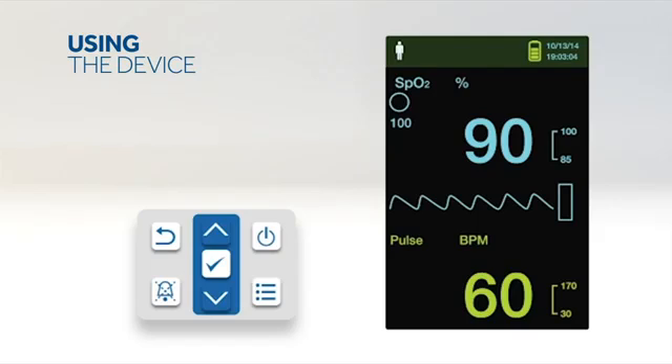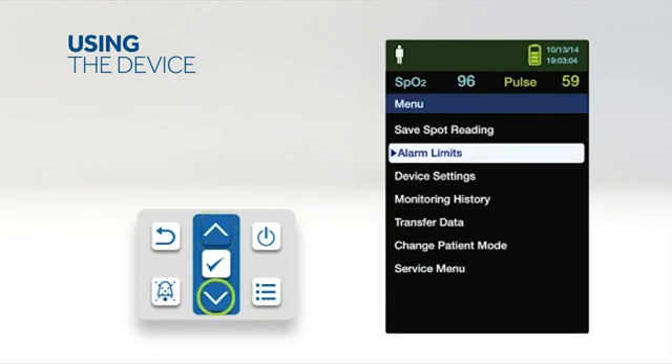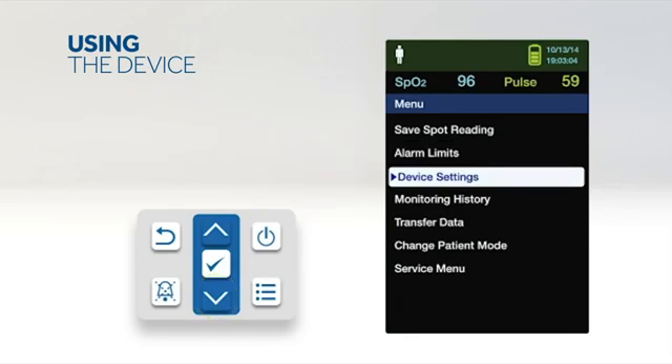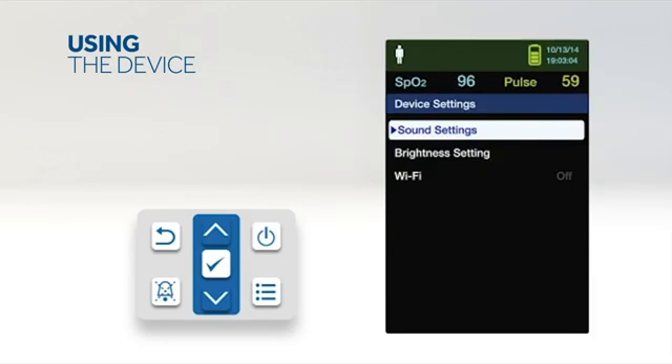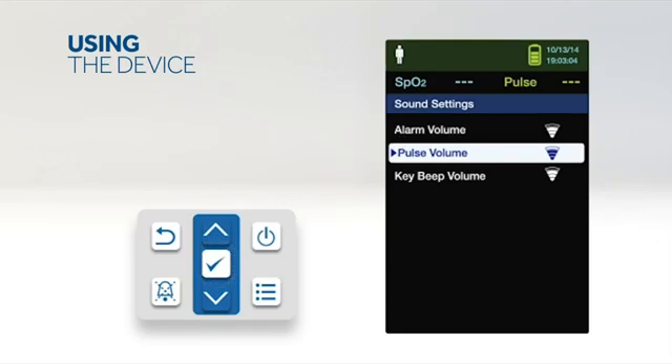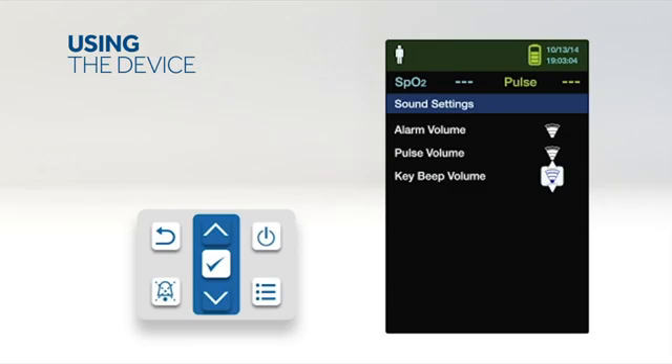Access the device settings menu to adjust the monitor's brightness and volume. Press the menu button, then press the up or down button to highlight device settings and press OK to select. To set the desired audible tone volume, select the sound settings menu, press OK to select alarm volume, then press the down arrow and OK button to highlight and select pulse volume or key beep volume. Adjust to the desired volume level.